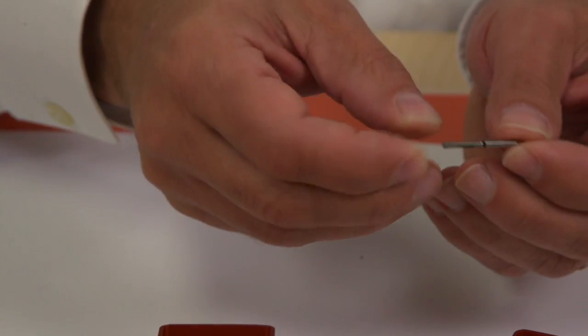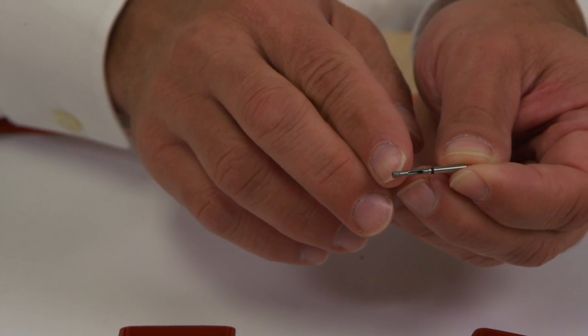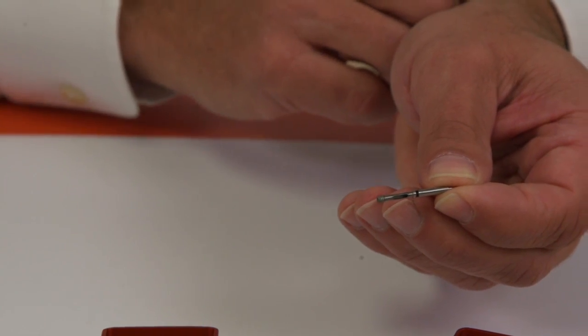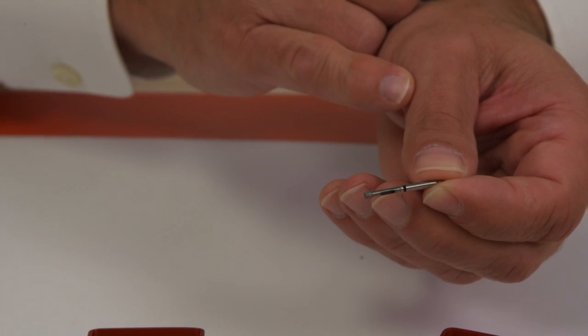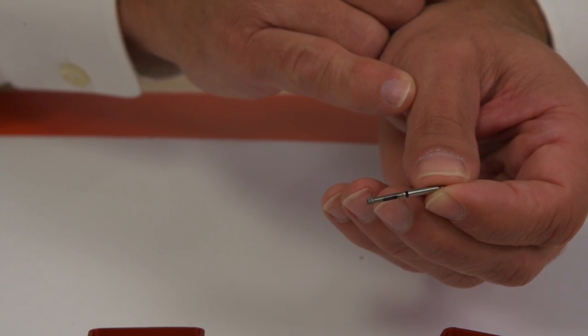For removal of endodontic posts, the hollow drill has diamonds on the outside as you'll be coming in contact with metal. Drill down and expose about a millimeter or two of the endodontic post.